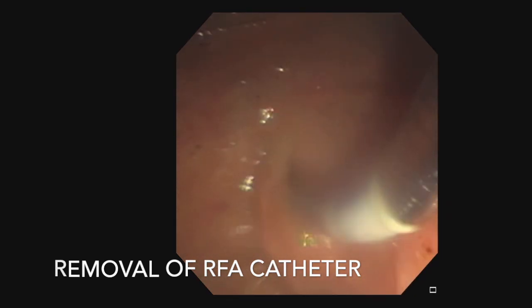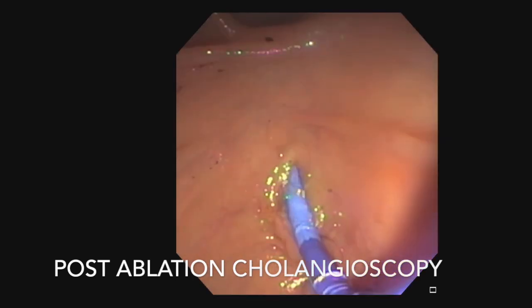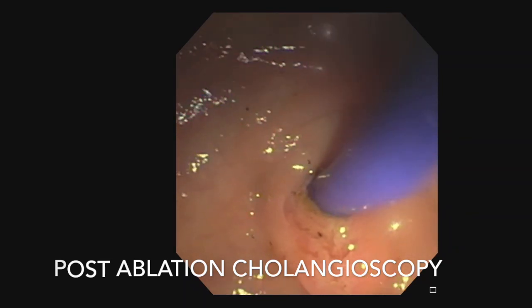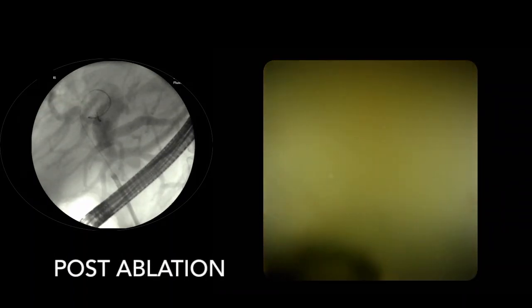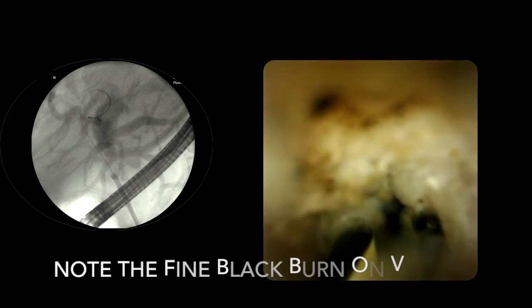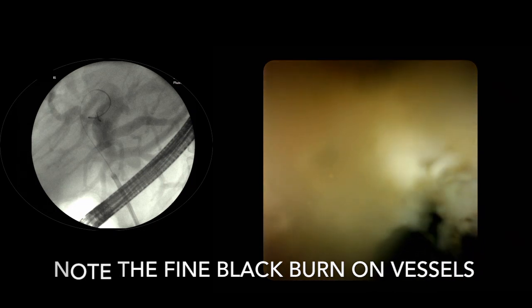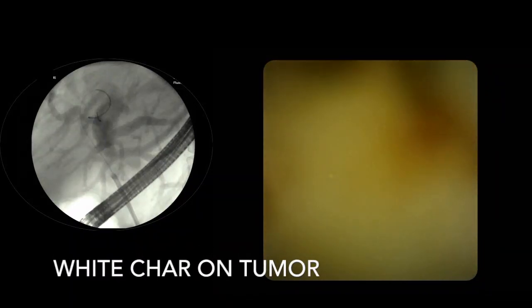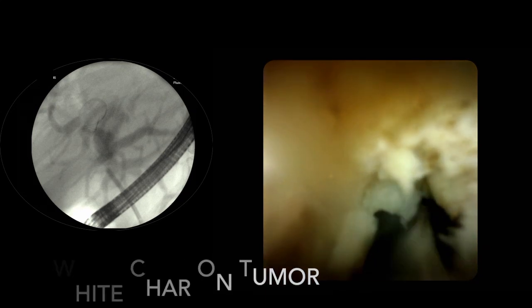After the second ablation, we wait one minute and then remove the catheter. On post-ablation cholangioscopy, recall the pre-ablation images showing high visibility of small vessels feeding the tumor. Now you can note the classic white charring appearance within the intra-biliary mucosa. Additionally, black specks are visible — these are actual burnt vessels which were previously visualized prior to ablation. The white char in the tumor confirms ablation efficacy and that the ablation zone covers the entire area of stricture and tumor.